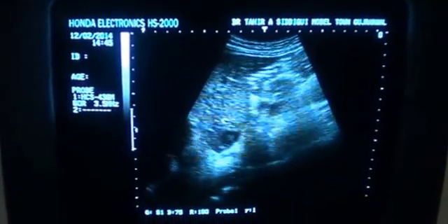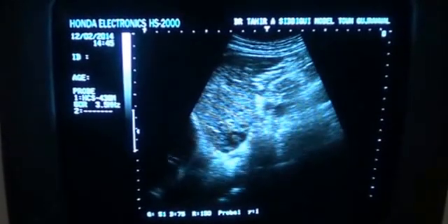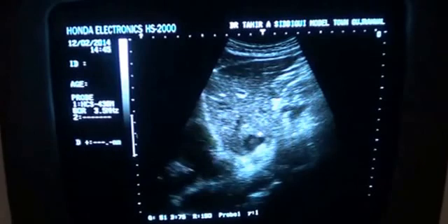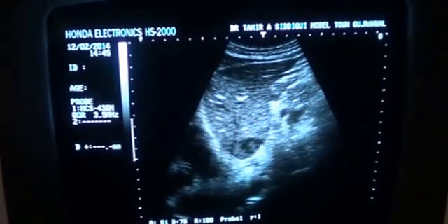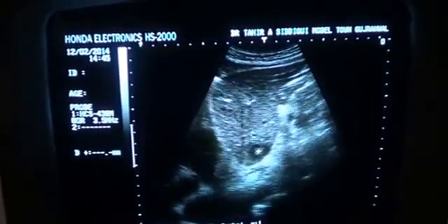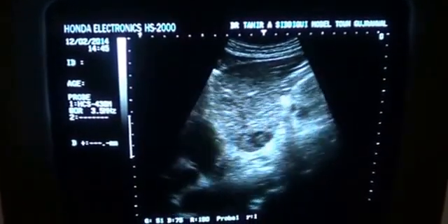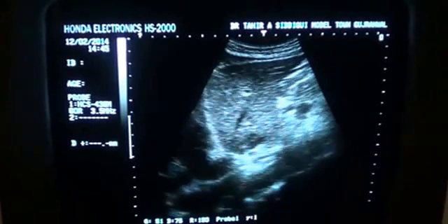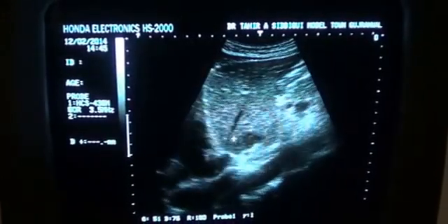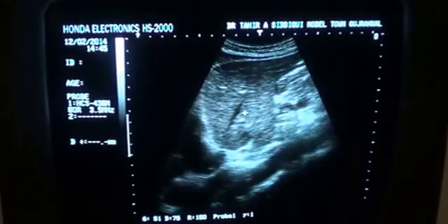This is another Besson segment showing you the left lobe of the liver, a longitudinal section with the focal lesion that is echogenic in the center and is surrounded by a hypoechoic rim. This is the left hepatic and hepatic vein — this is the left hepatic vein.